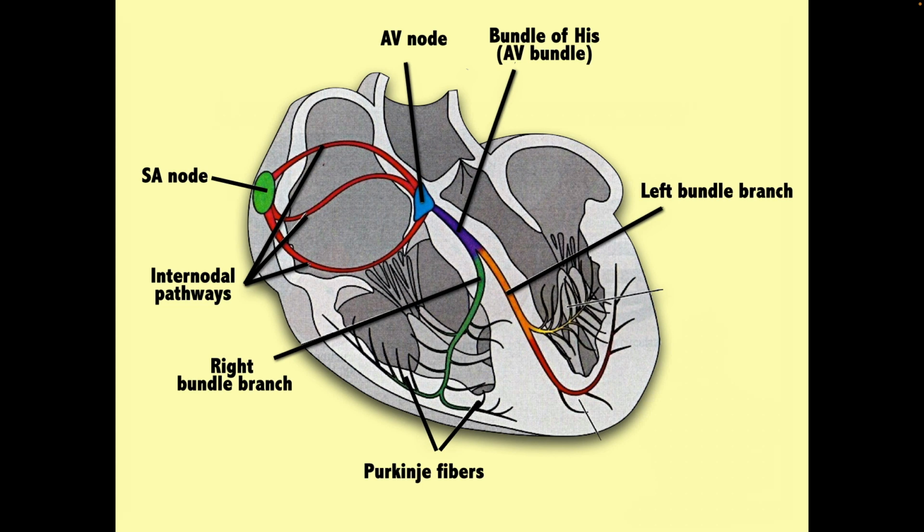That's most of the time what happens with a sinus rhythm. Atrial rhythms, let's say the pacemaker is here. Impulse starts from the pacemaker here, goes to the AV node, goes down into the ventricles, jumps on the speedy conduction system, boom, narrow QRS. Let's say the pacemaker is here, a junctional rhythm.